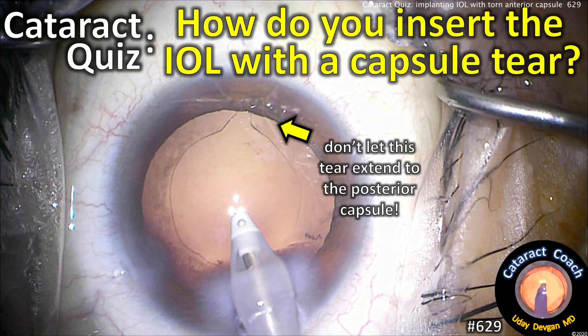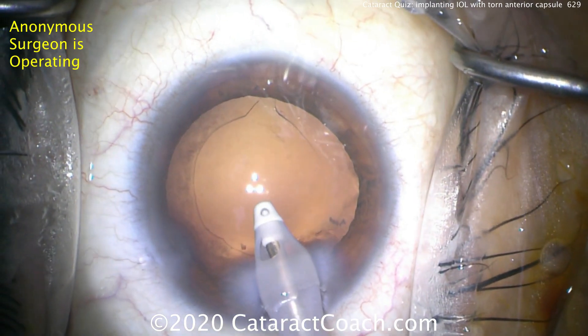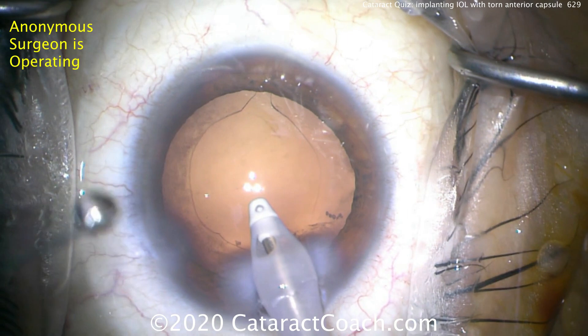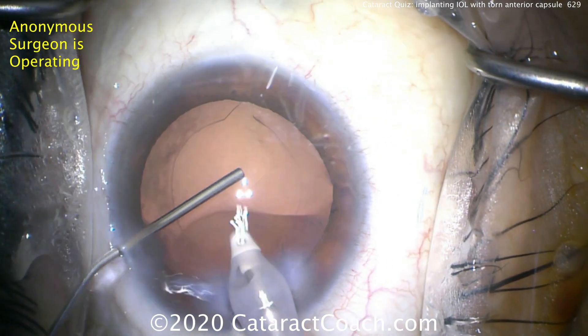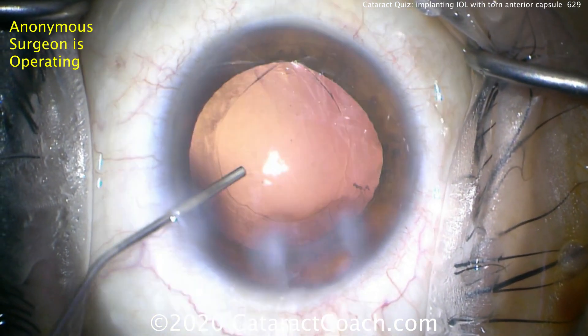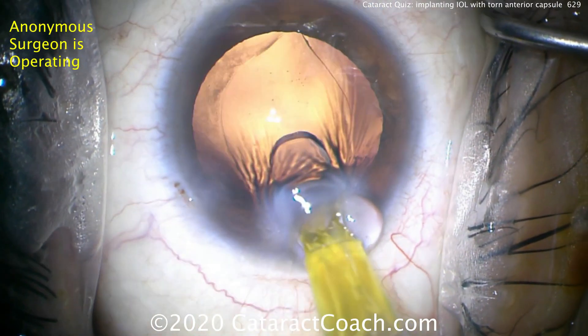Cataractcoach.com cataract quiz: how do you insert an IOL with a capsular tear? You have an anterior capsular rim tear and you don't want it to extend to the posterior capsule. After all the cortex has been removed from the eye, don't deflate the eye. Go in with the second hand — the left hand — injecting cohesive viscoelastic, then come out of the eye with the IA probe, keeping the eye inflated. Don't over-inflate it.